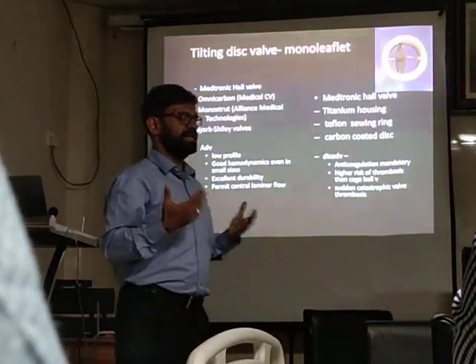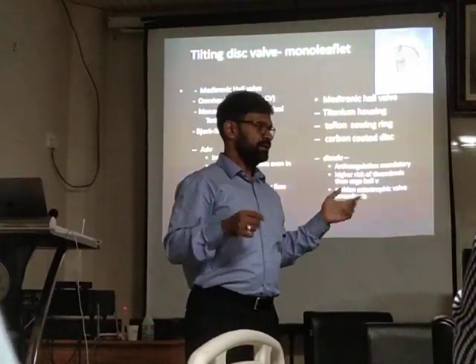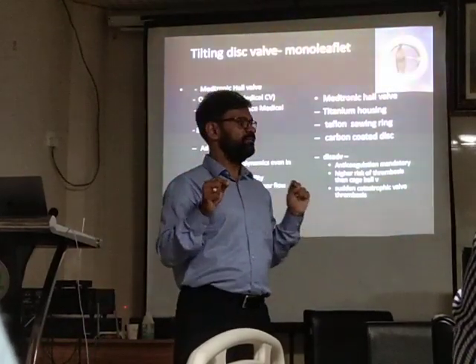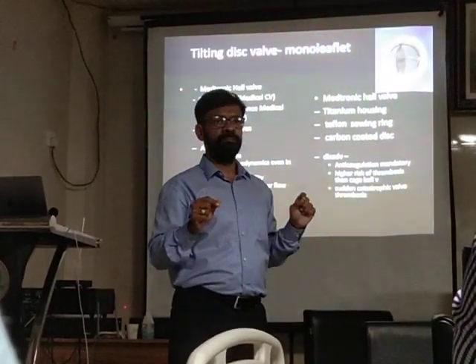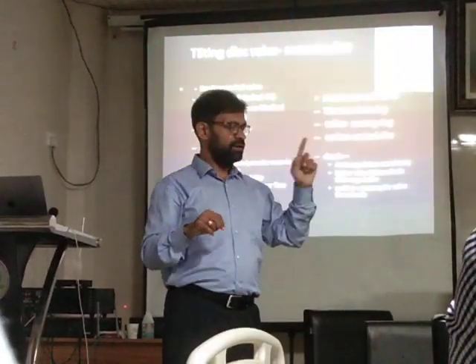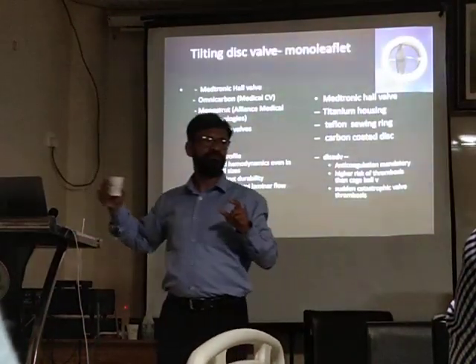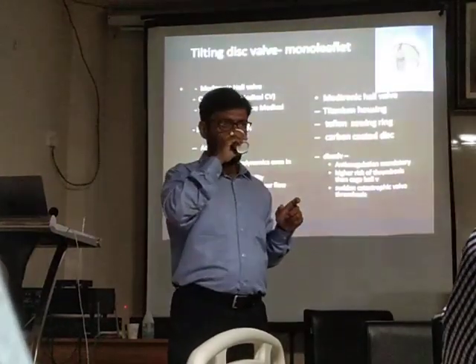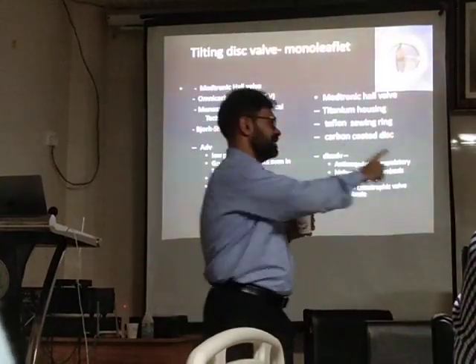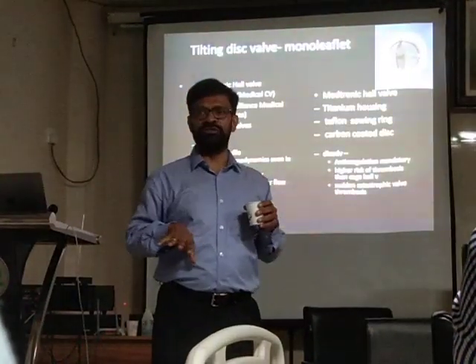So, doctor, the patient has sudden onset breathlessness at the end of 3 months. Our echo will show it. Now the question to all the guys, mitral prosthesis is seen best in which view? Mitral valve prosthesis is seen in a cath lab in which view? In fluoroscopy. So question and homework for all of you, which you are going to tell sir tomorrow. Mitral valve prosthesis fluoroscopy.